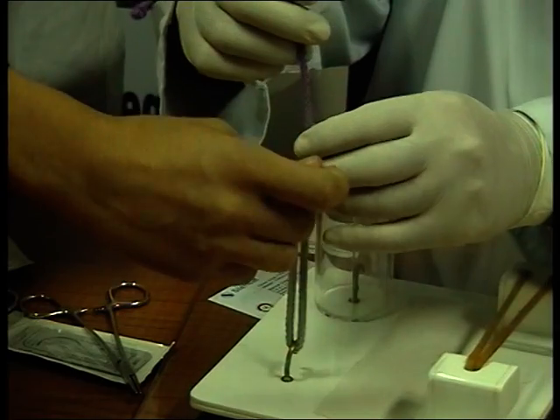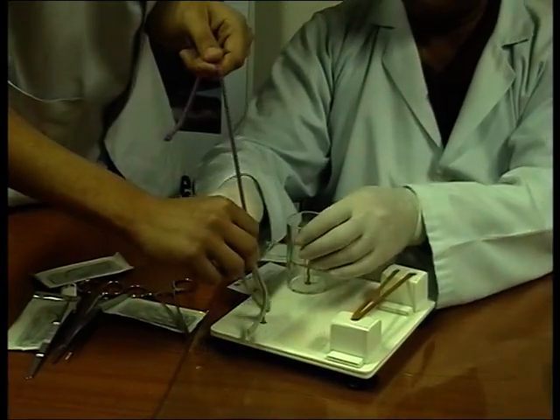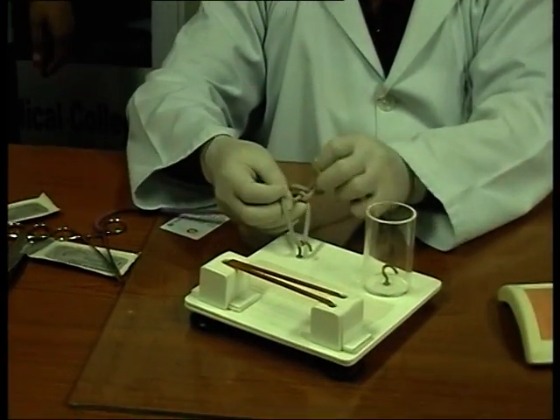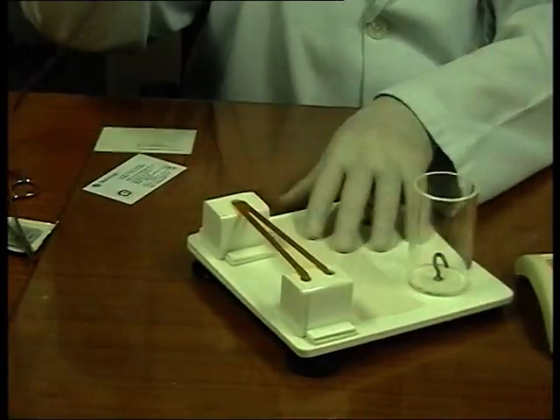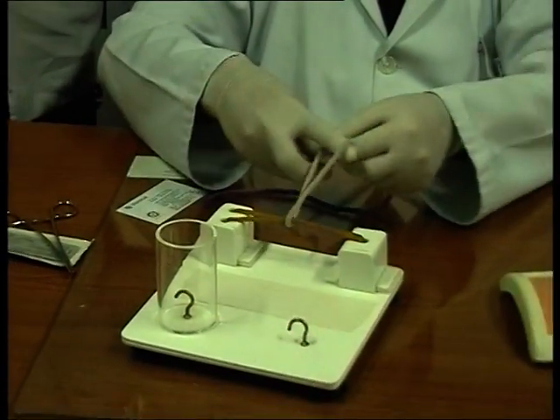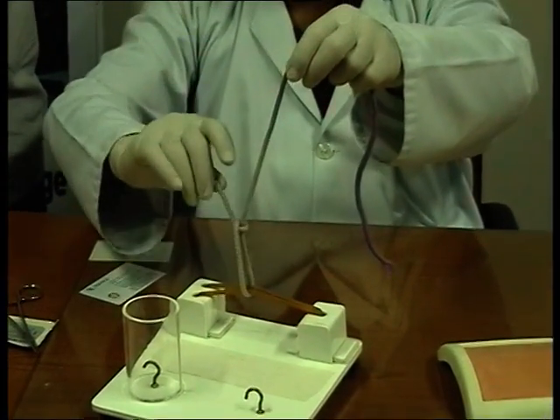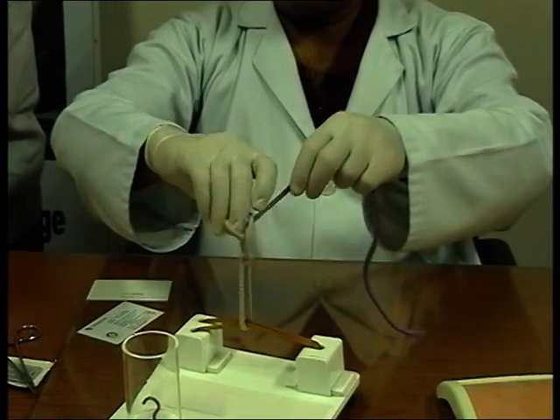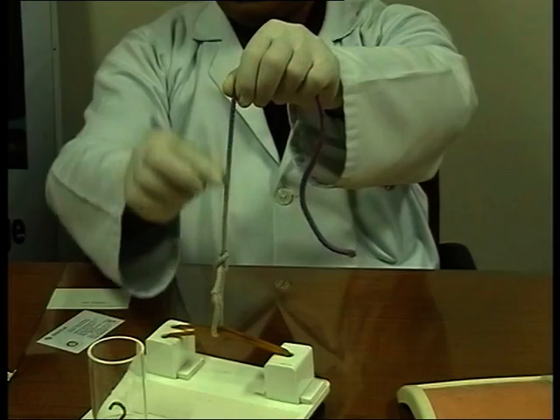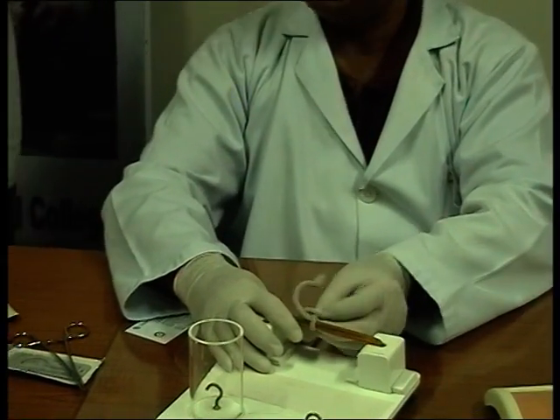Now what happens usually, there is one mistake also. If you try and keep it straight and taut, actually this is a thread which is supposed to stay straight. And you keep on putting slip knots on top. It will automatically be straight. Understood the principle? You understood the principle of the slip knot?